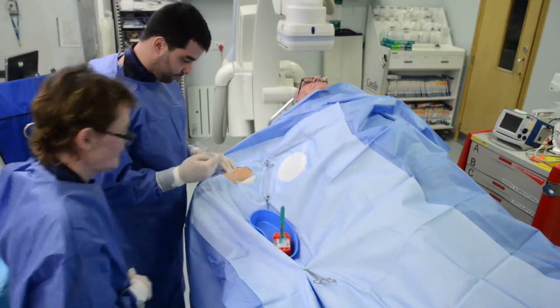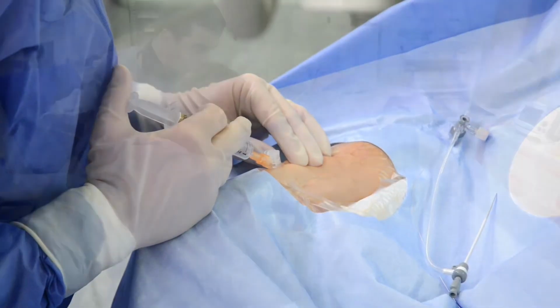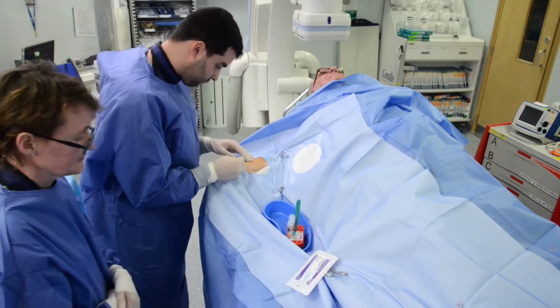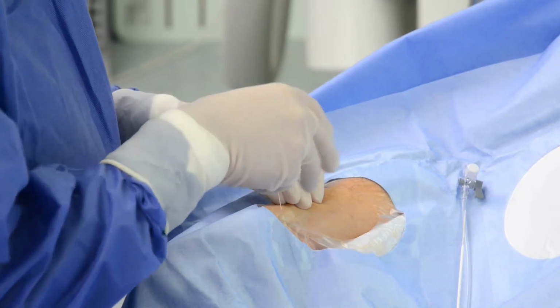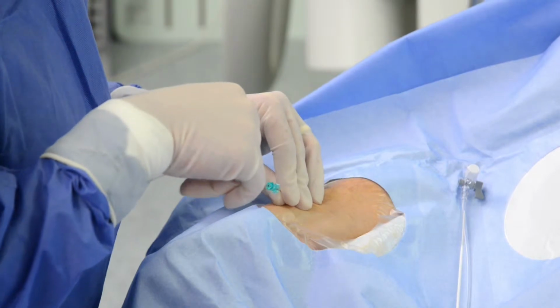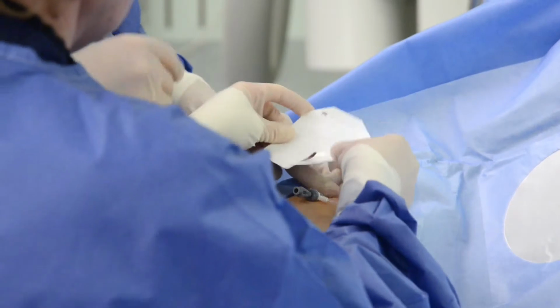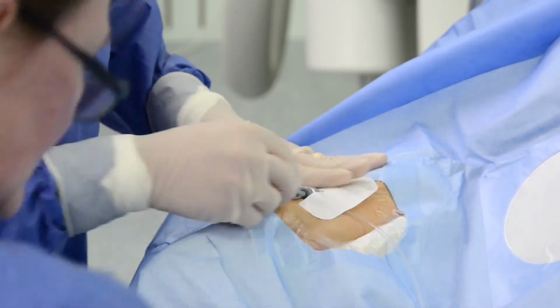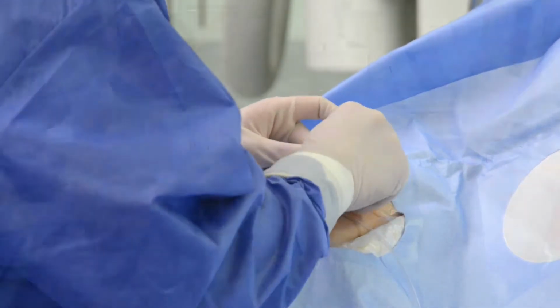The procedure is done under local anaesthetic around the incision site, which may sting. Following the local anaesthetic, an incision will be made into your artery. A small straw-like tube is inserted into the artery to gain access. You may feel slight pressure at this stage. If from the wrist, you will be given some medications into the tube which will relax the artery, but you may feel some burning sensations. This is a normal feeling and will last a few seconds.